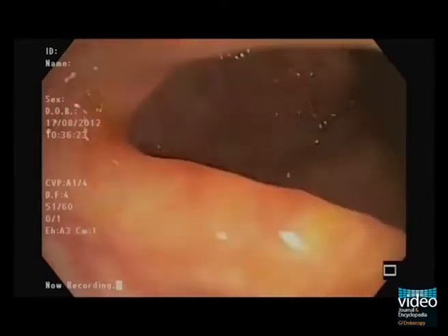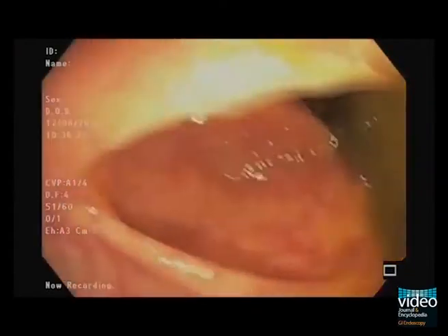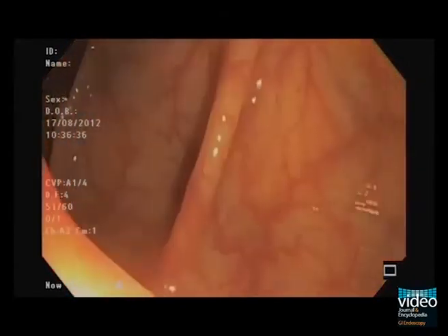The transverse colon has a typical triangular configuration and is enveloped by the transverse mesocolon peritoneum. The degree of droop of the transverse colon towards the pelvis accounts for the variable bowel length and influences the acuteness of the hepatic flexure bend. In older patients, there is often a mid-transverse angle.